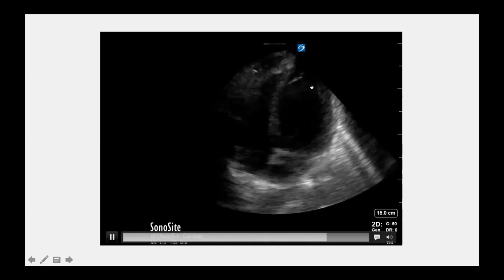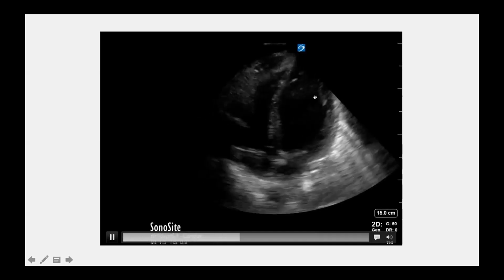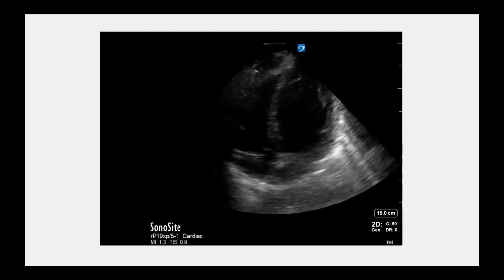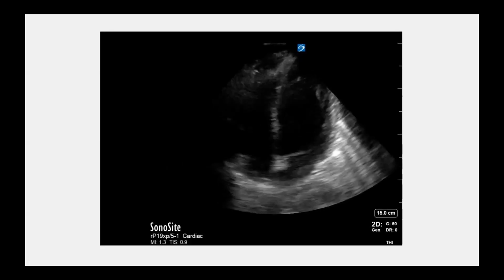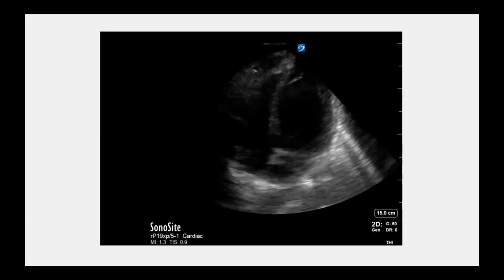So this patient, let's say, has an LV aneurysm, this is somebody on EKG that you see persistently elevated ST elevation from old EKGs, not representing acute MI. Or you may see something like this in a patient with Takotsubo as well, with apical ballooning.